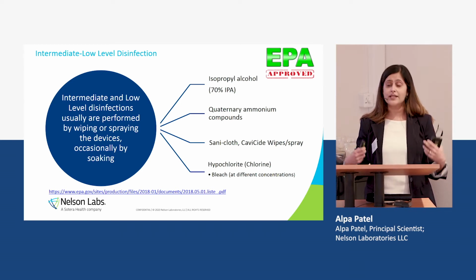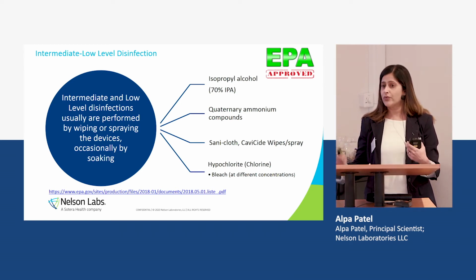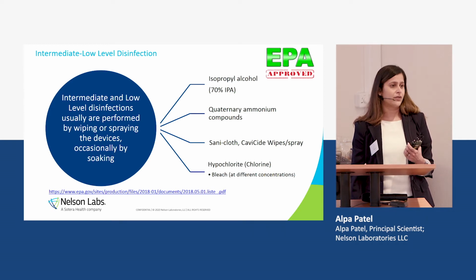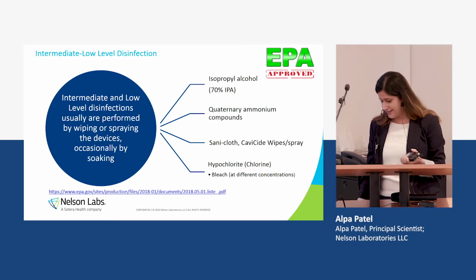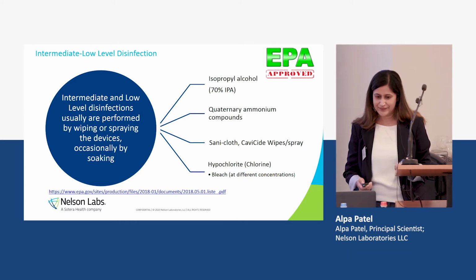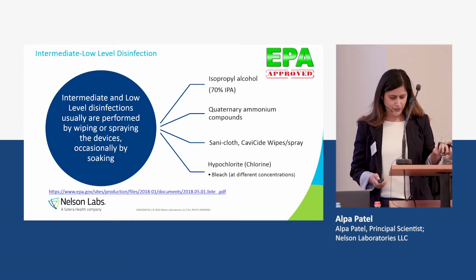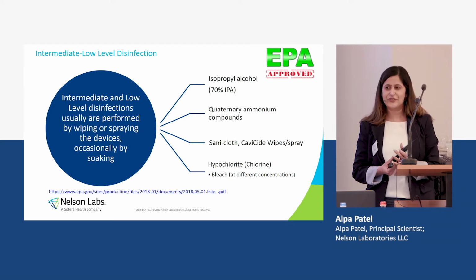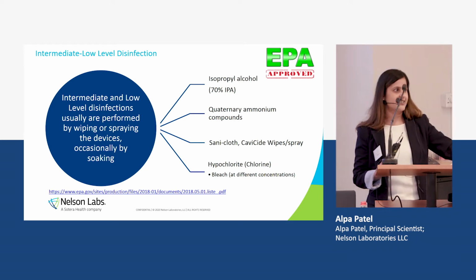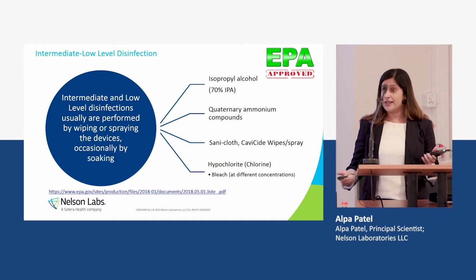Hospitals are definitely not going to follow that, and I think today we've learned that whatever we validate is just for us and just for the books, and for the regulatory agencies, what happens in healthcare is what happens in healthcare. We just have to look the other way sometimes. And who was it, you, Henry, who said that when you go to the healthcare facilities, the IFU is just tossed? I have seen that myself.